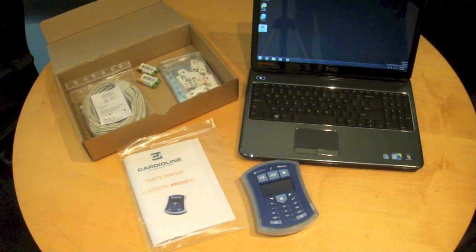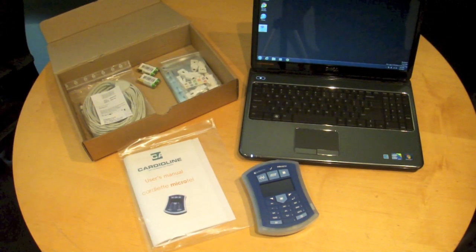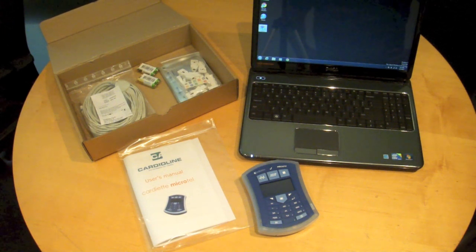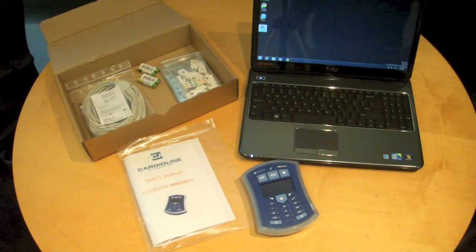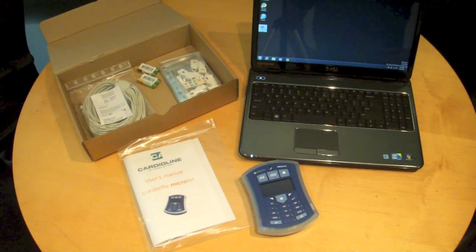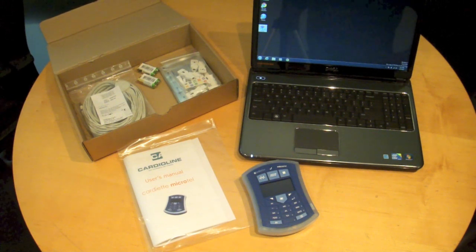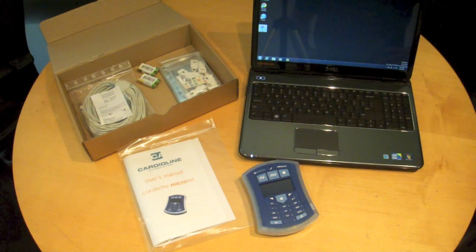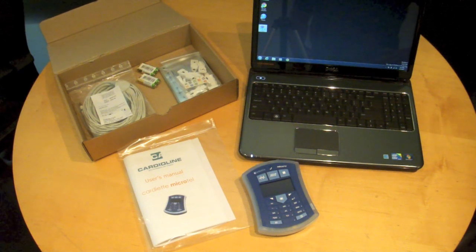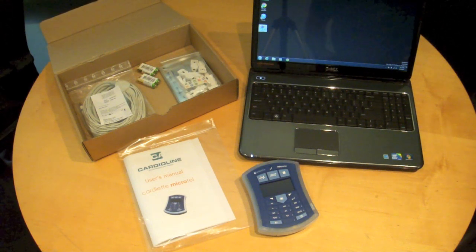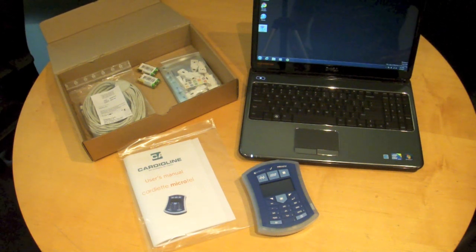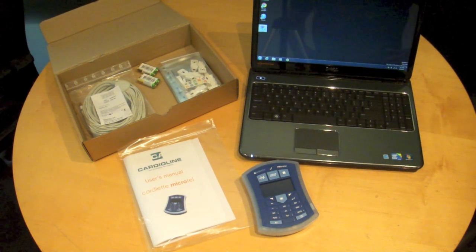Today we're going to be talking about the Cardioline MicroTel handheld and PC based ECG. It's the first in the industry to offer both a small compact handheld standalone EKG with a one lead preview screen and keyboard as well as the ability to pass real-time data from the device to a computer.